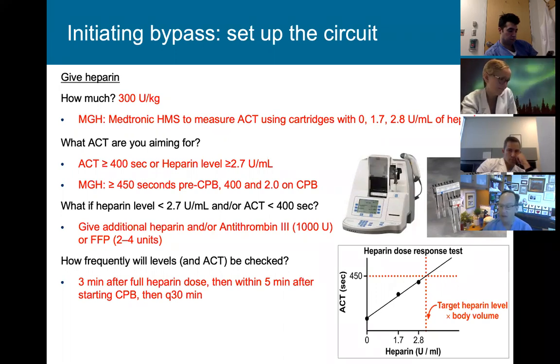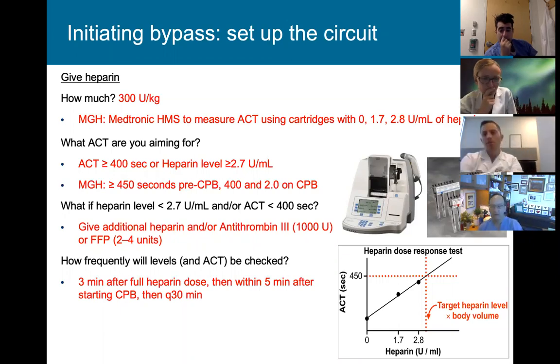The second point is that giving heparin, or failing to give it, is what nuclear engineers call a single point vulnerability. If you go on bypass without giving heparin, the patient will die. That's it. You're done. Operation's over. You absolutely have to be 100% certain that the heparin has been given, which was George's point. Great, thank you.